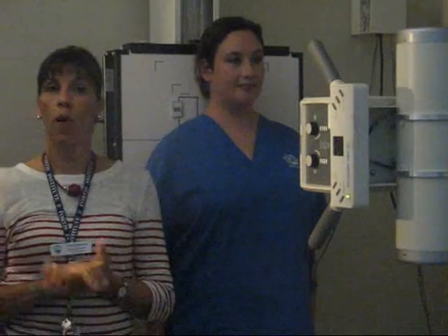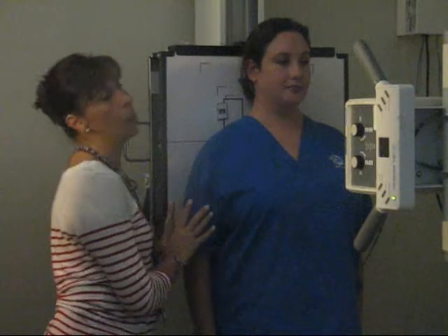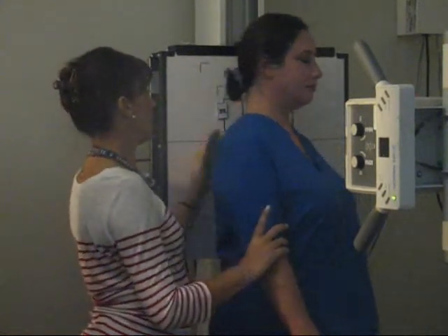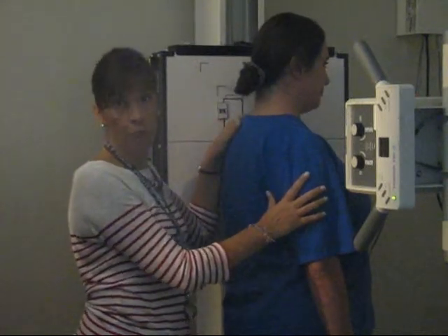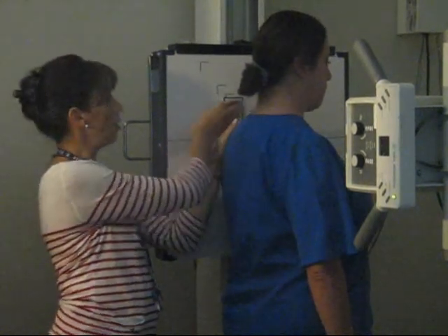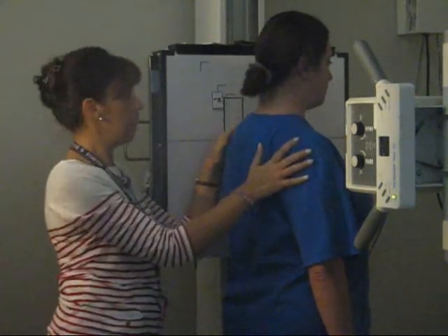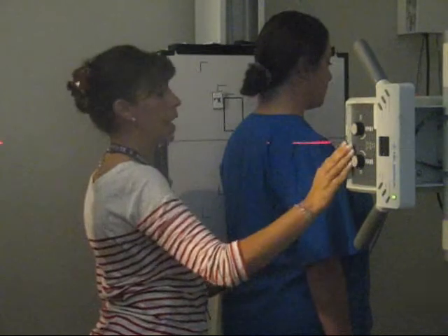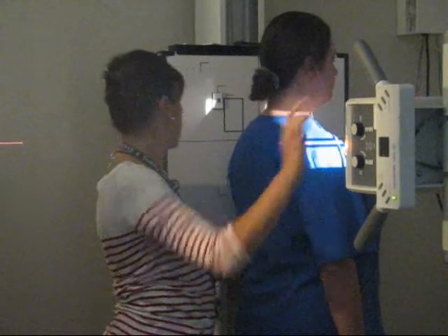Occasionally, your doctor may request another projection called a PA oblique view, which is also better known as a Y view, okay? In the Y view, we want to see that the scapula is intact and in good position in relation to the shoulder. Your affected side closest to the IR, in this case, we're going to say that her affected side is the left side, okay? So your affected side closest to the IR, you're going to still be at 40 SID.